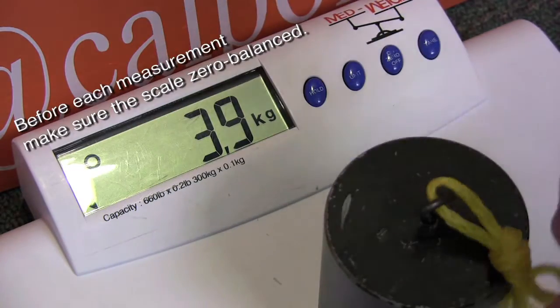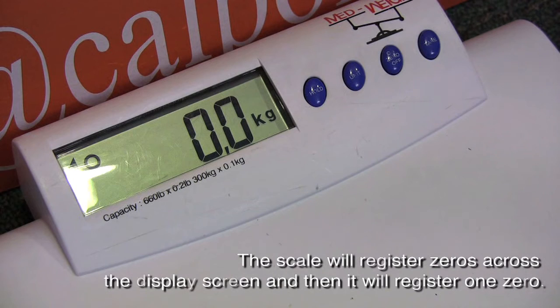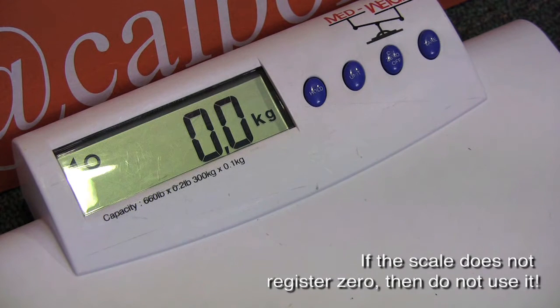Before each measurement, make sure the scale is zero balanced. The scale will register zeros across the display screen and then it will register one zero. If the scale does not register zero, then do not use it.